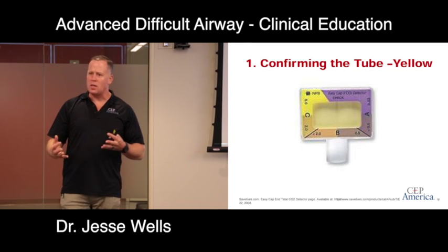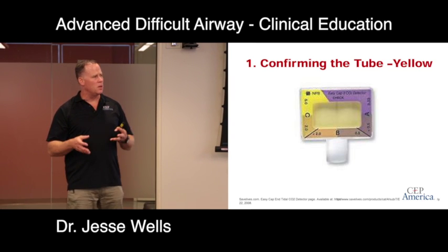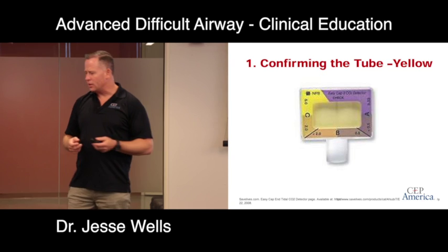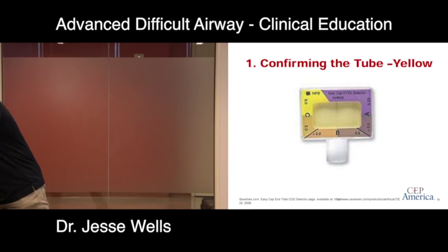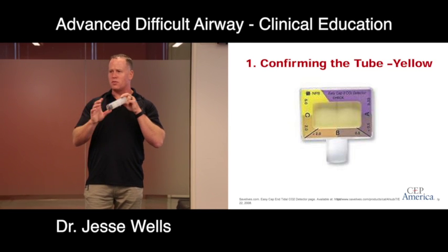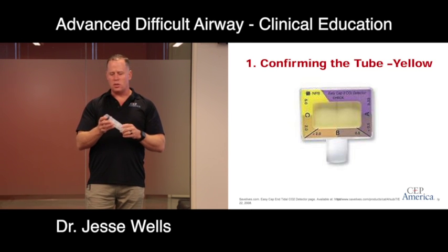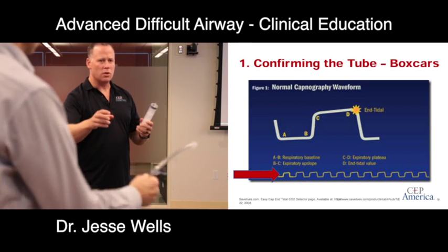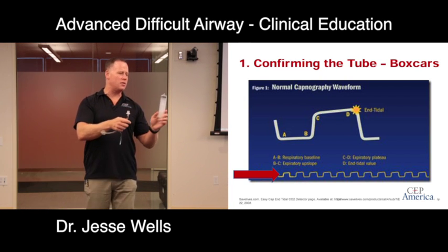So what's a way that you can immediately confirm tube placement in a patient that's arrested? Exactly. So this is not the right type of catheter. I'm talking about the ones that have the catheter tip that the nurses use for NG tube placement. But what you do is you tip the... can you hand me an ET tube, please? Yeah, so it's called a Toomey syringe, and it's got a catheter tip different from this one.